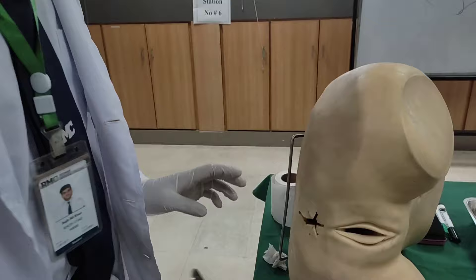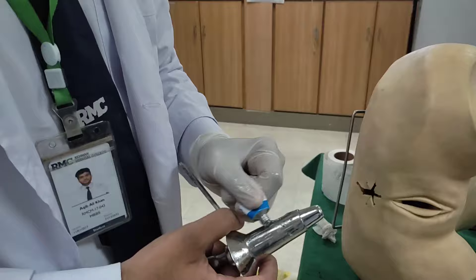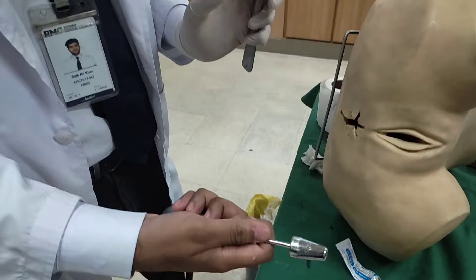If we want to use proctoscopy, then the same thing — we have to take the lubricant and put it here. Let's go over the parts first. This is the obturator, this is the sheath, and this is the handle.